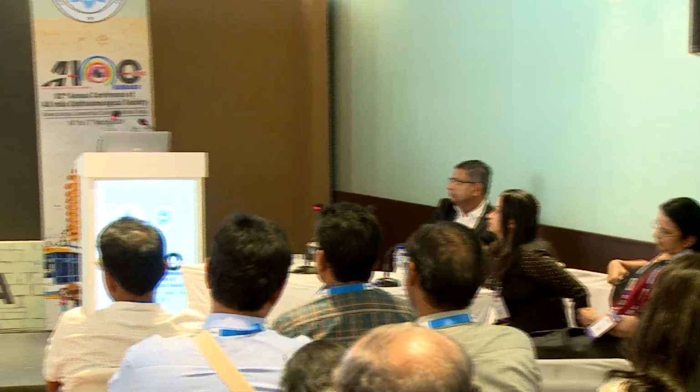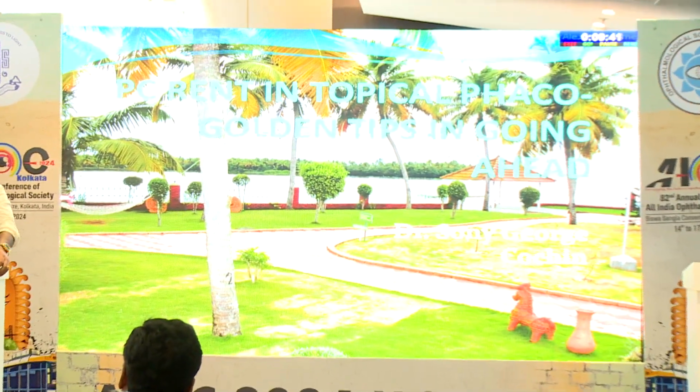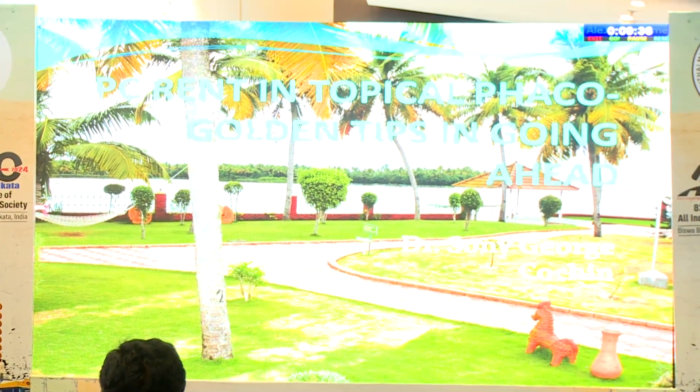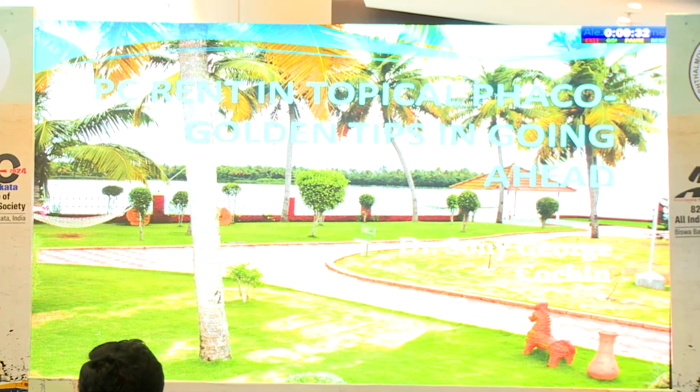Good afternoon once again. We'll be talking about PC rent in topical phaco. As we know, we would have planned the best for the patient, probably even a multifocal or a premium IOL implant. But when a rent happens, it happens. The more cases you do, the more rents you have. Experience plays a part, of course, but this is part and parcel of the game. The same happens in topical phaco also.